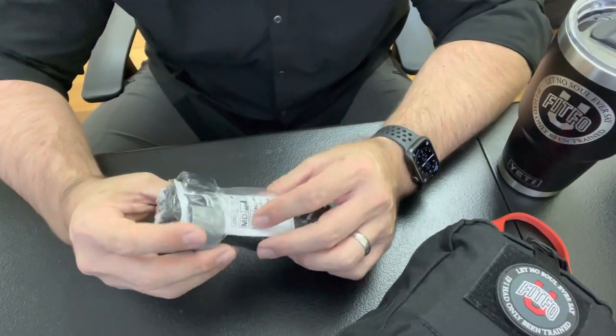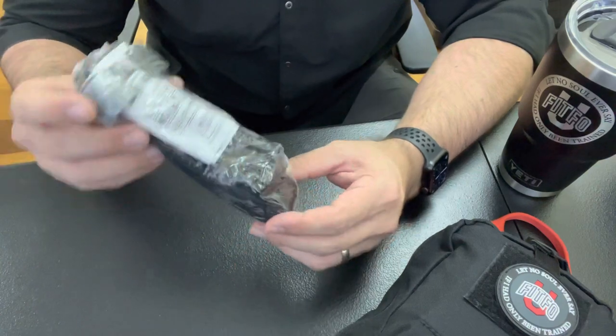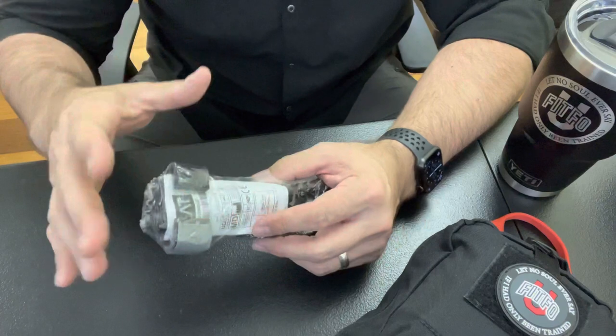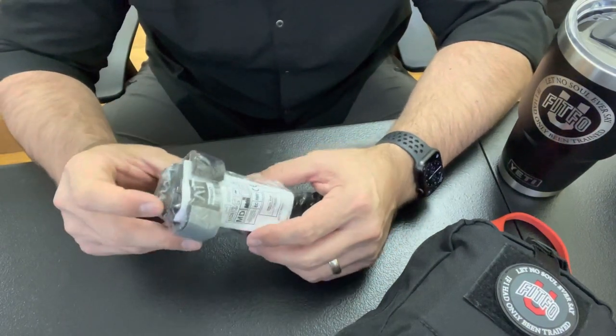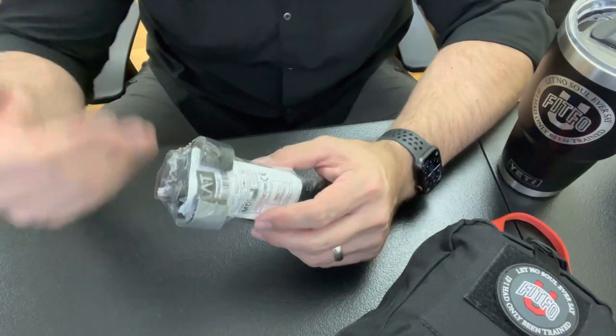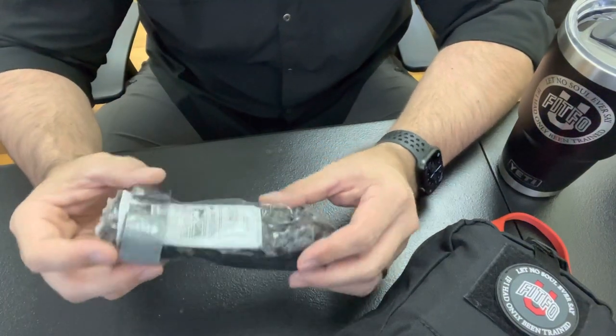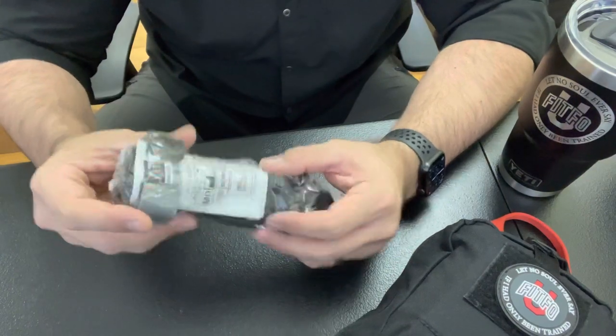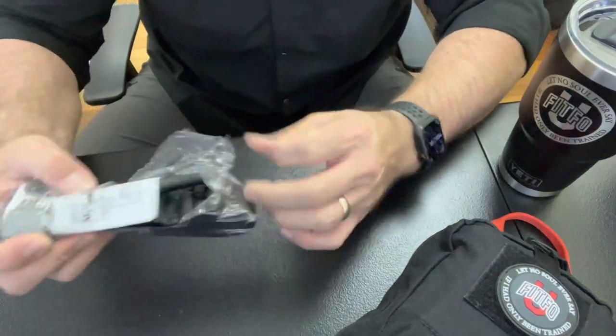Today I'm going to talk about preparing a CAT tourniquet — how to prepare it, how to get it into a bag, and how to stage it the way it needs to be. One of the first things: you don't want to have it in the plastic it comes in, so make sure it gets taken out. If you ever have to use trauma gear like this, it's likely to be the worst day of your life, so if your hands are all bloody, you definitely don't want to be digging through plastic.